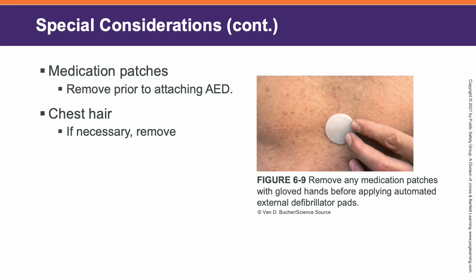Also, if a man's really hairy and you're trying to attach the pads, they may not stick completely. It has to stick to their skin for it to be effective. So you may have to shave some of the hair on their chest. We'll talk about the stuff that's in the AED later, but a razor is typically in an AED.